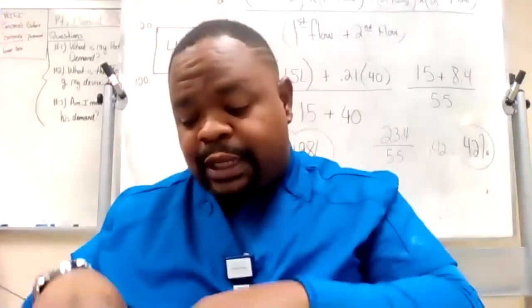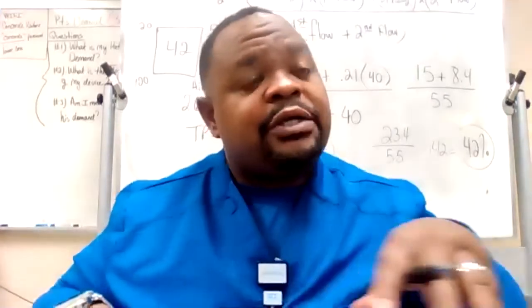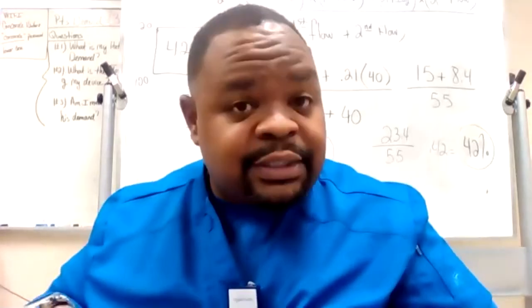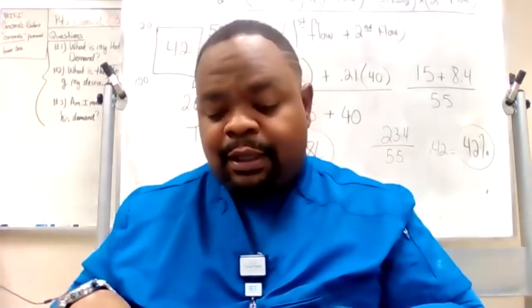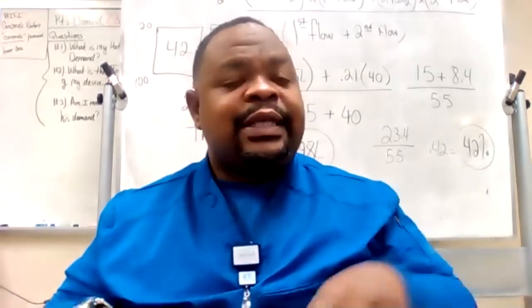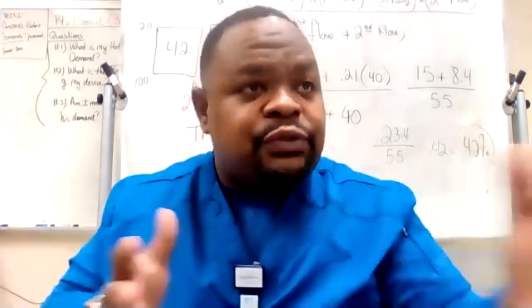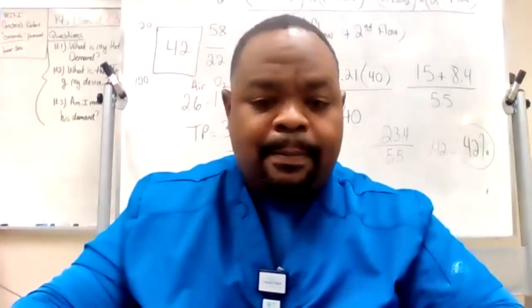All I need you to know is that when I name an oxygen analyzer, you have to tell me whether it measures the partial pressure of oxygen or the actual percentage of oxygen. And then you also have to tell me how to calibrate the oxygen analyzer. Calibration is something that has to be done before you can use it, to make sure it is in the right ranges. So here we go.